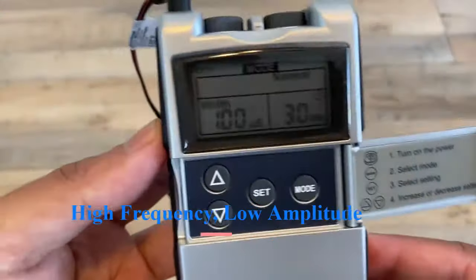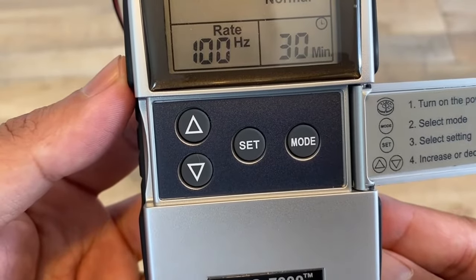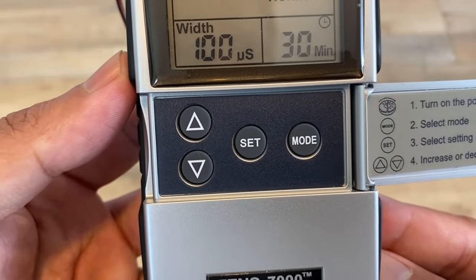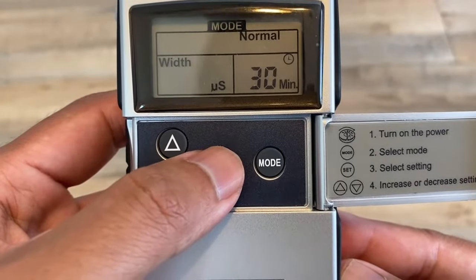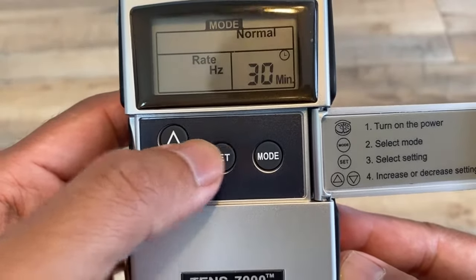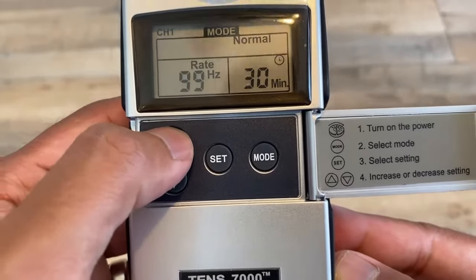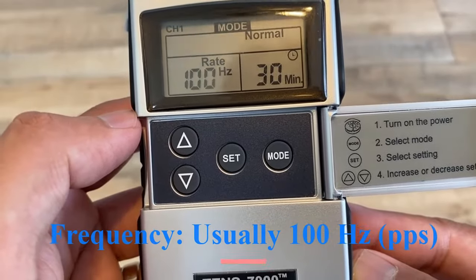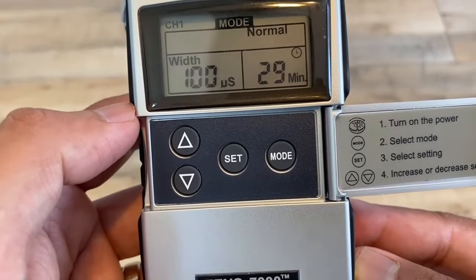If you look at the parameters, the rate is 100 hertz and the width is 100 microseconds. If you wanted to change that, just hit 'set' and you'll see it flash — then you can toggle it down or up. Hit 'set' again to change the rate from 100. Note that hertz is synonymous with pulses per second; on some machines you may see pulses per second, but most likely you'll see hertz — they are the same.